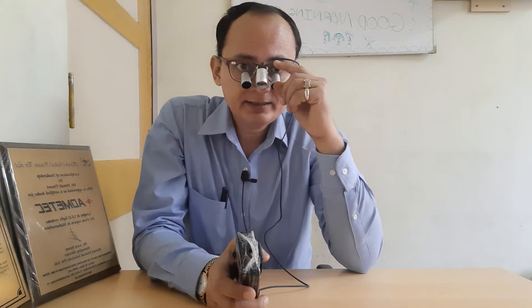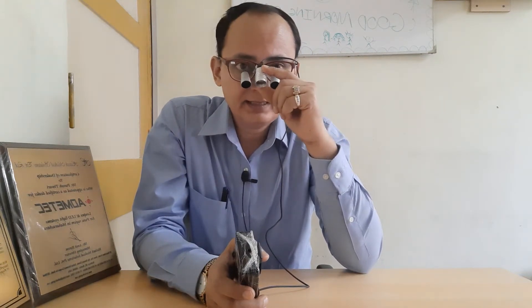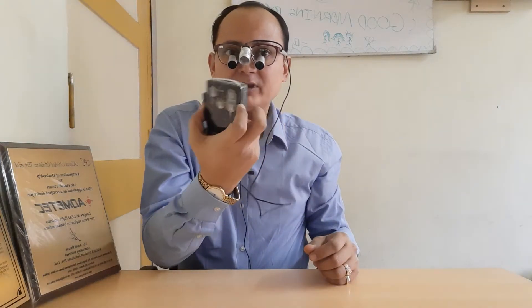Hello friends, I am Paresh representing Admetik Loops. In this video I will explain you about our Orchid F light. Orchid F light is the one that I am wearing right now. The light is wired and it has got a battery that you can keep in your pocket.